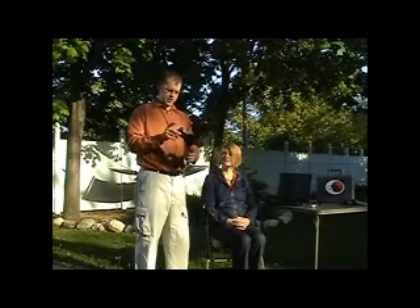I prefer to hold ProVision's camera setup with my index finger on the battery to control the illumination, my left thumb on the Panoptic's focus tumbler, and my right hand on the camera proper with my index finger on the snapshot button. This allows for a very stable configuration when holding the camera in front of the patient.